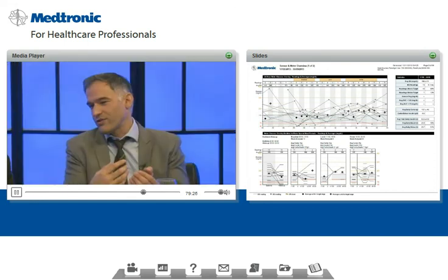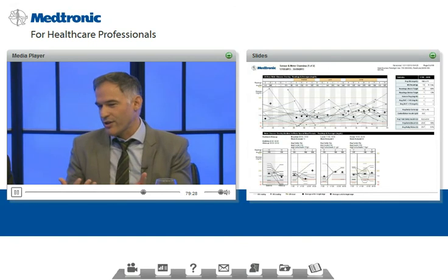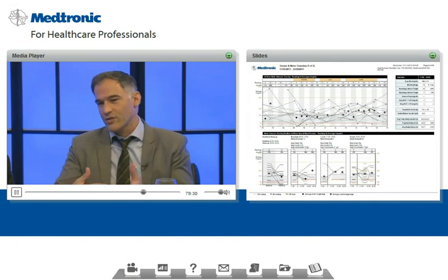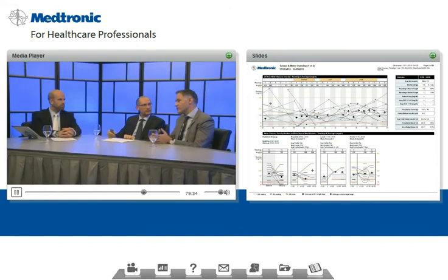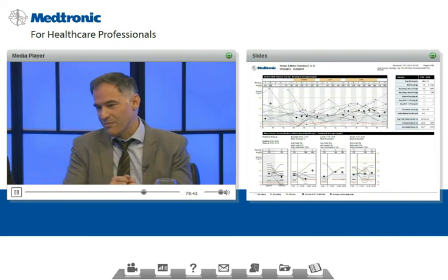Yeah, and actually just for you to know, in my clinic, it's true that we could leave the downloads in the hands of a nurse educator and a dietitian. To me, it's critical that patients come into my clinic with that information, because I have 15-minute visits. If I have the outputs, I can make a decision about blood sugars confidently within a few minutes and actually deal with the important stuff.